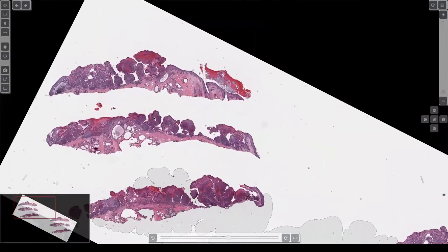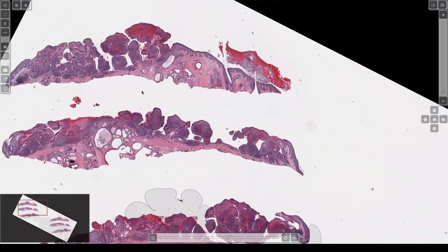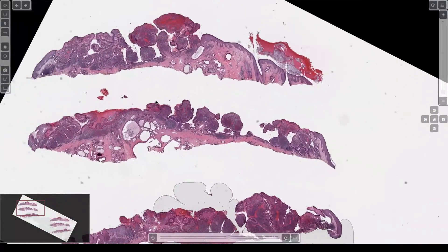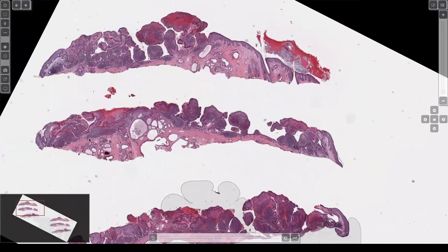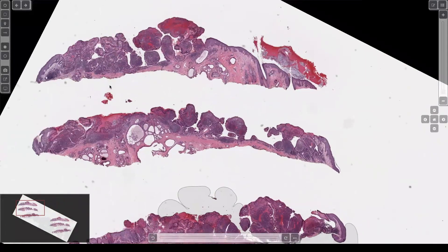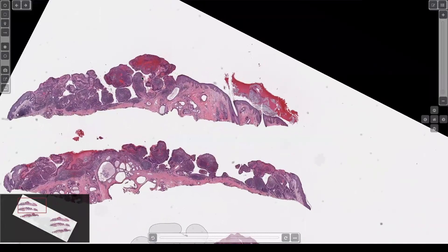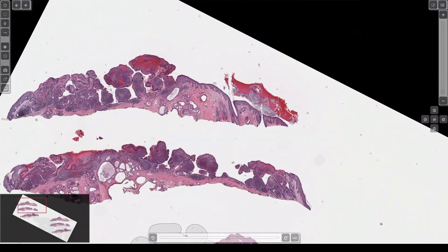Look at this. I have kind of a funky, weird looking lesion here. It's papillomatous on the surface. It's ulcerated a little bit. And it's got these kind of clefting spaces pushing down that have little islands floating in them.